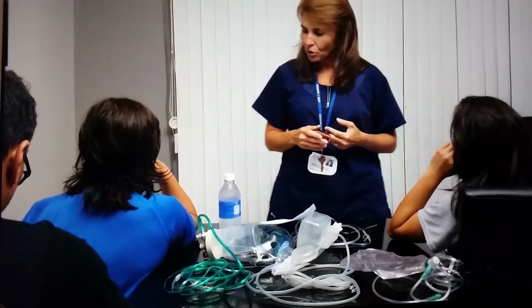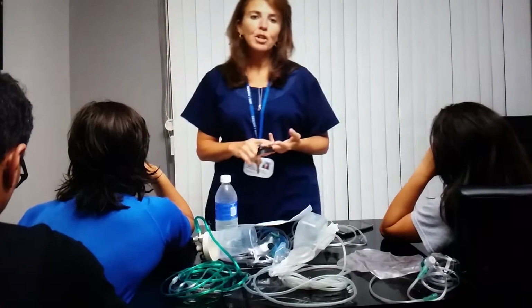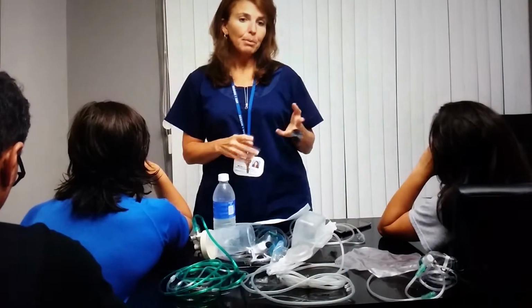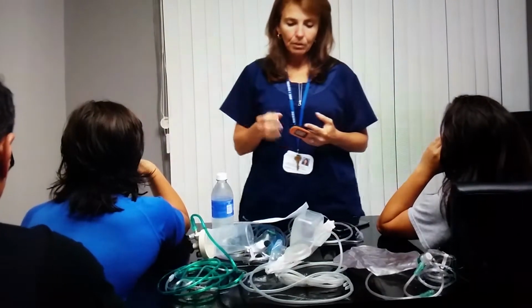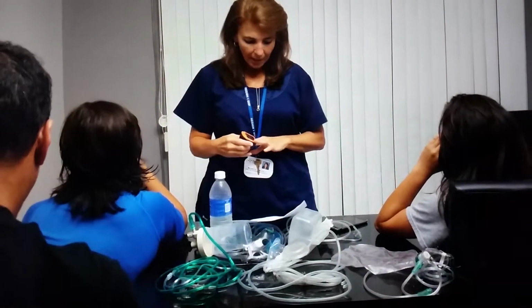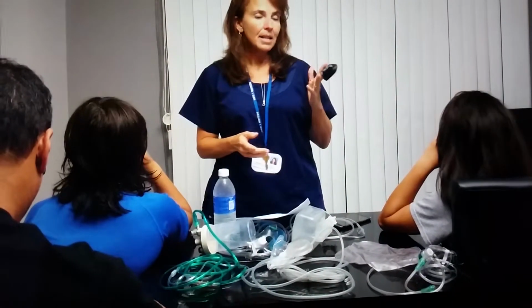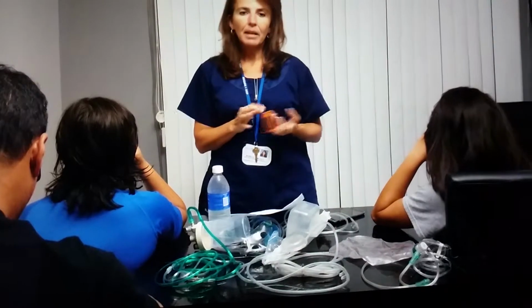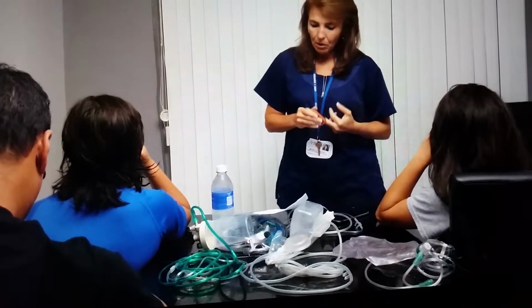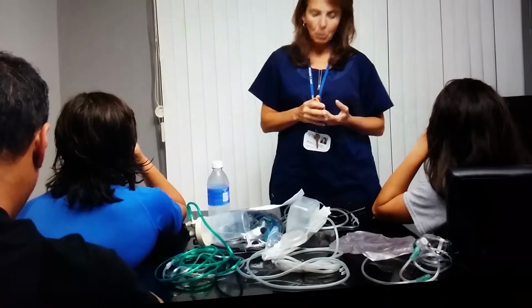You also want to make sure that you avoid hands that are edematous or possibly cold, or if the patient has low blood pressure or poor perfusion, you would want to possibly use an earlobe for the reading. Other things that can affect a reading are excessive ambient light, as well as artificial nails and dark nail polish. So you'd want to avoid those areas as well, or make adjustments accordingly.